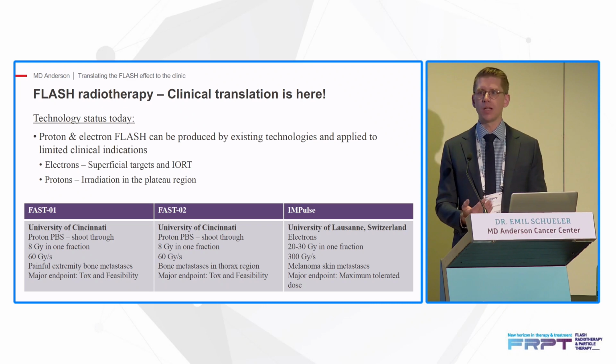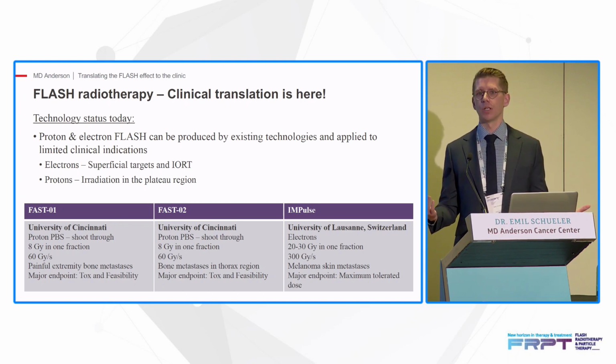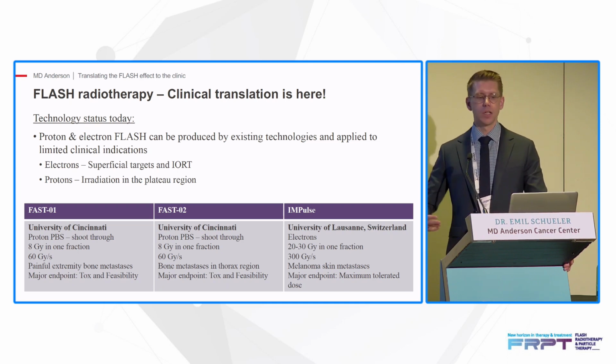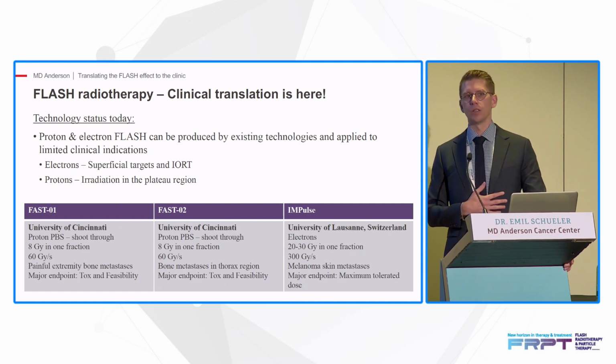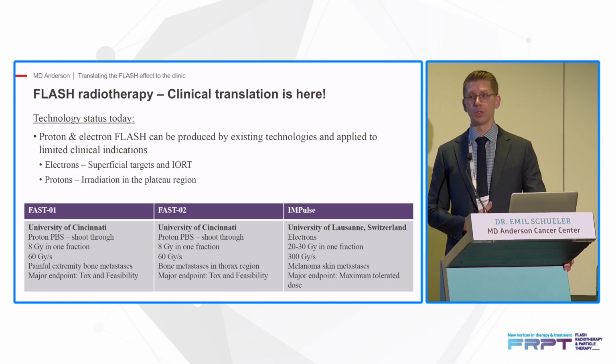For limited indications, yes, but for electrons, for example, I know many centers are pursuing trials based on cutaneous lesions on the skin, but we can also do intraoperative radiation therapy in that setting. In protons, irradiation in the plateau region is something that we can do with transmission beams, but there's also new exciting development there with conforming to the tumor with flash dose rates.